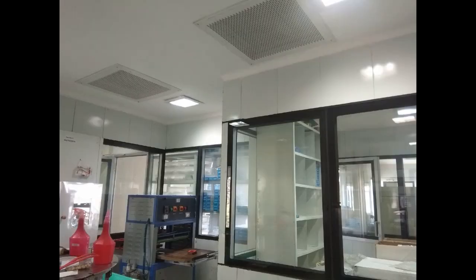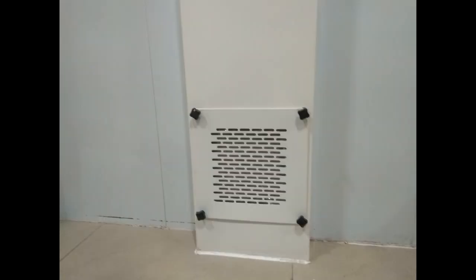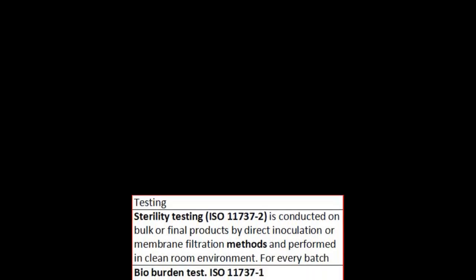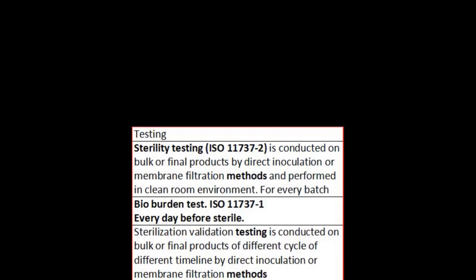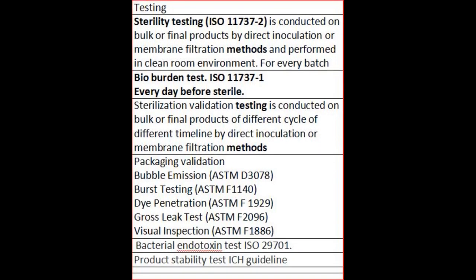All processes are done in a clean room environment containing 0.3 micron HEPA filter, 5 micron pre-filter, sophisticated aseptic manufacturing and QC testing. Sterility testing, ISO 11737-2, is conducted on bulk or final products by direct inoculation or membrane filtration methods and performed in a clean room environment. For every batch, bioburden test, ISO 11737-1, every day before sterilization.